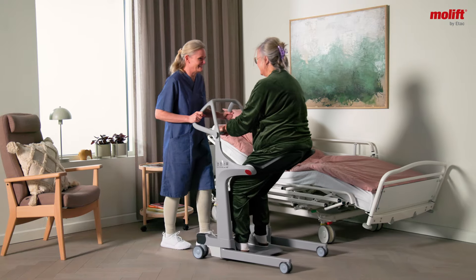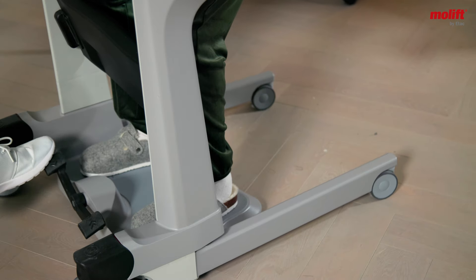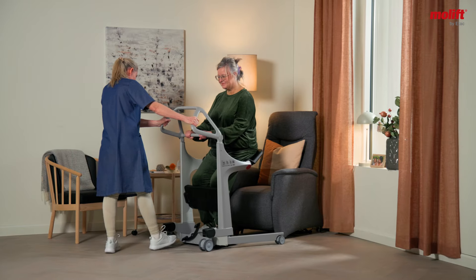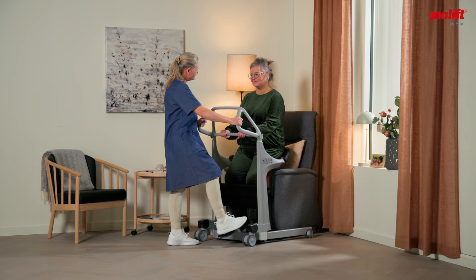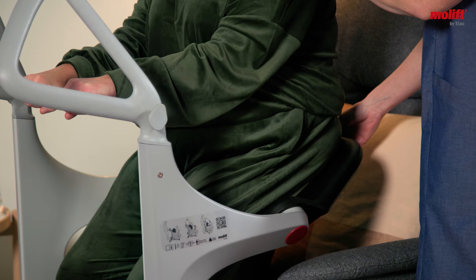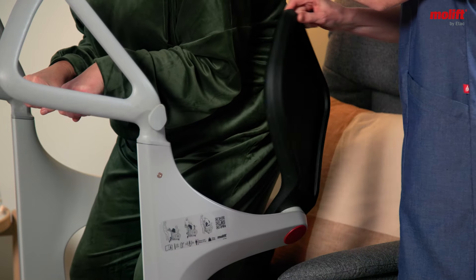Ergonomic and intuitive functions make it easy to use and facilitate transfers, providing a safe and comfortable experience for both the user and the carer. Early rehabilitation is encouraged as the user benefits from actively participating.